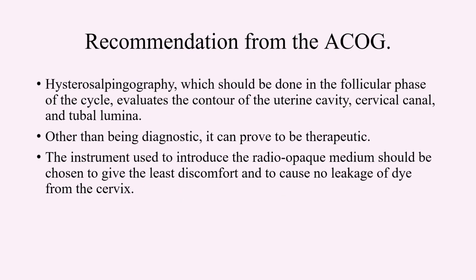The American College of Obstetricians and Gynecologists recommends that hysterosalpingography should be used and can be done in the follicular phase of the cycle to evaluate the contour of the uterine cavity, the cervical canal, and the tubal lumina. Other than being diagnostic, it can prove to be therapeutic in some cases. The instrument which is used to introduce the radio-opaque medium should be chosen to give the least discomfort and to cause no leakage of dye from the cervix.